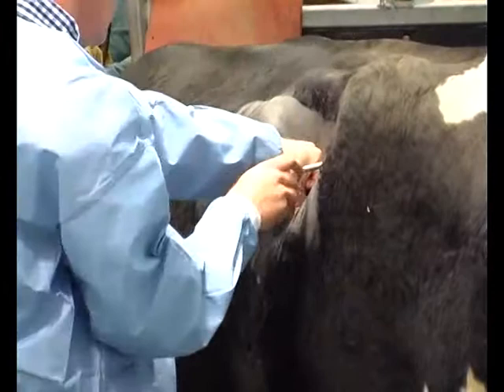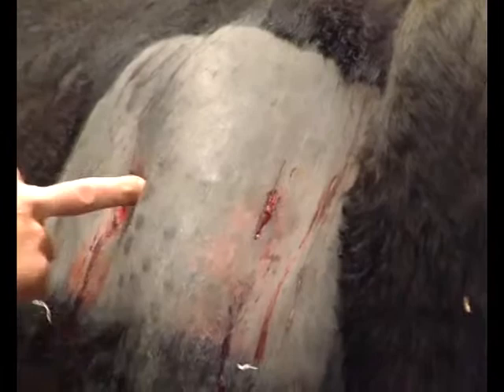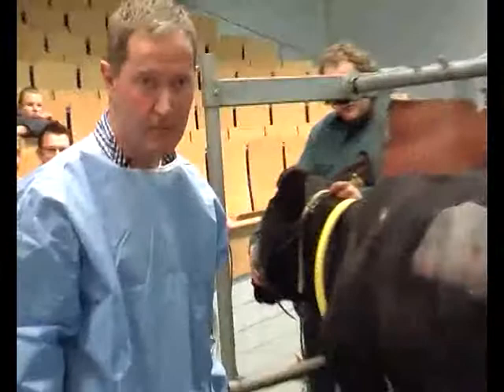And also Heinz, he didn't put any suture on these places. Sometimes I use the spare part of this and bring it here. But that's the only one I close. I close this, and these two you leave open. We will close it in the stable. You will close it in the stable.